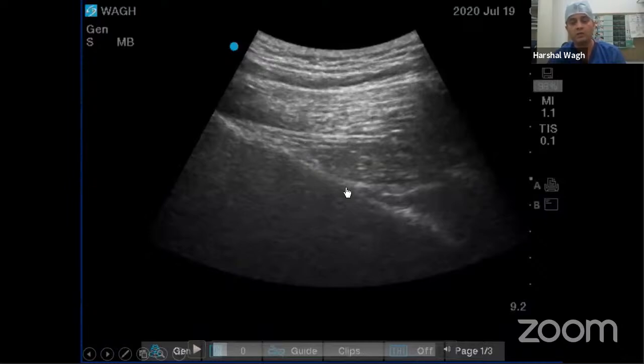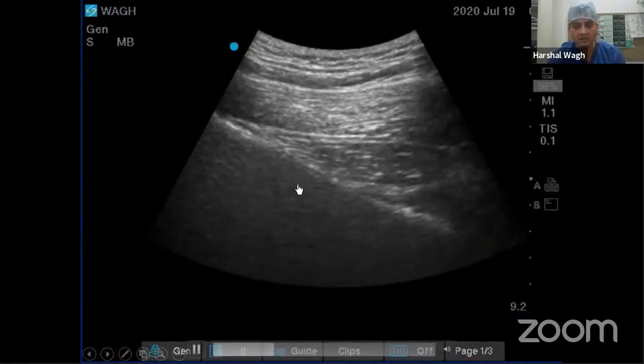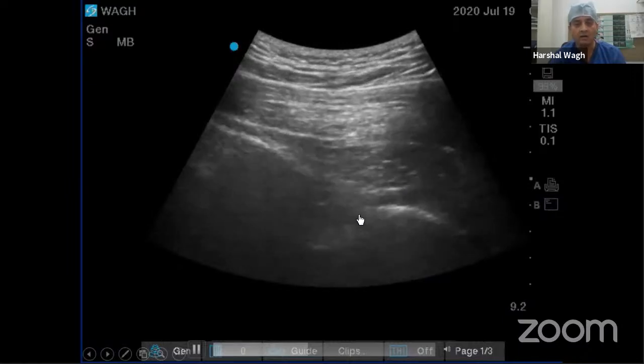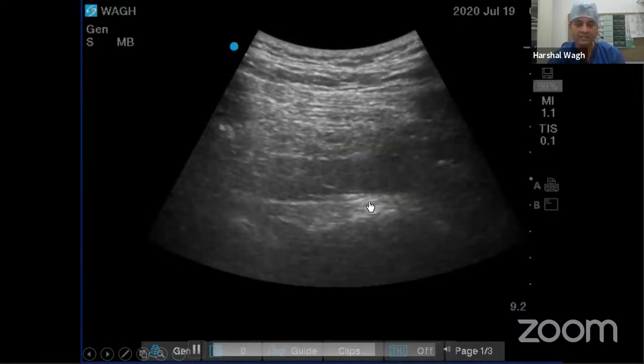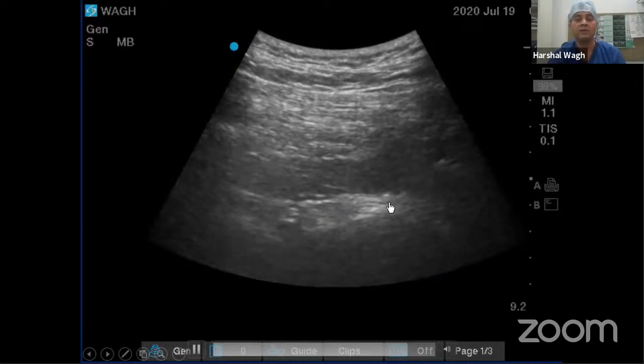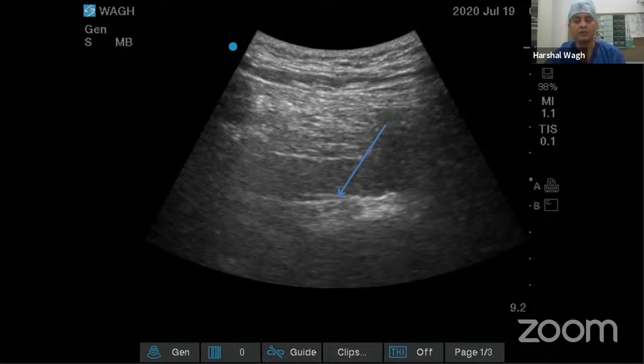This is what one would mean by the continuity of the bone, which is the ala of the ilium, and you'd see the musculature there. As I play the video, the movement of the probe is inferomedial. If you concentrate on this area here, there is a break in the continuity of that bony structure, and that represents the greater sciatic notch. As the scan moves down, one would quite easily see a hyperechoic sciatic nerve emerging from the greater sciatic foramen. Now, if I freeze that picture, one would easily make out that if I have to do in-plane needling, that would be my trajectory of the needle, and I would inject local anesthetic once I get close to the area, always using a dual guidance technique for doing these blocks, and also using Doppler in that area because you want to be aware of what blood vessels you're encountering along the way.